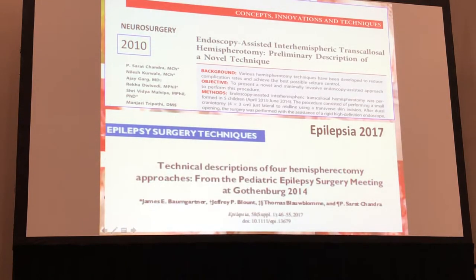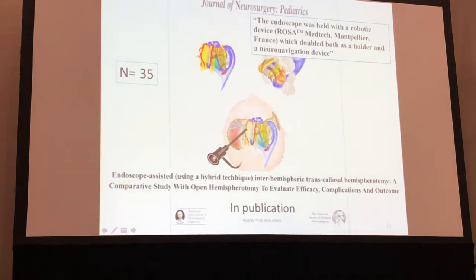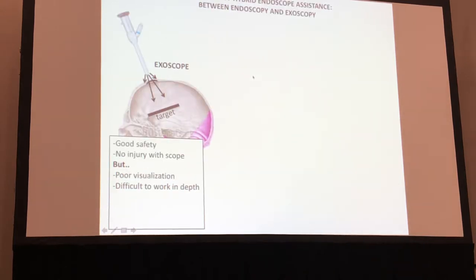We published our first paper in 2010 in Neurosurgery, and later on, it has been incorporated as one of the 4 accepted techniques for hemispherotomy. And more recently, we are going to come up with a consolidated series in Journal of Neurosurgery Pediatrics. And hopefully we should have this image on the journal's cover page. Now what we do is, we use a technique of hybrid endoscopic assistance using the robot.